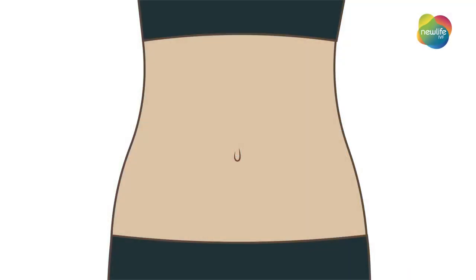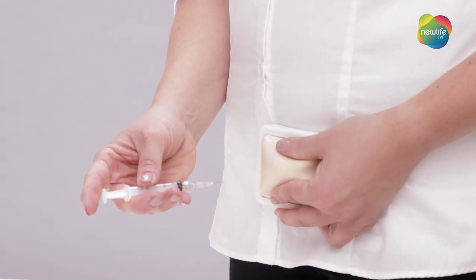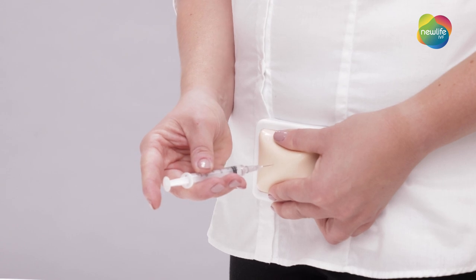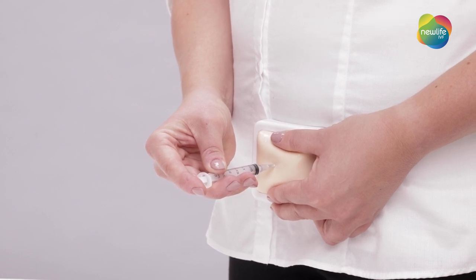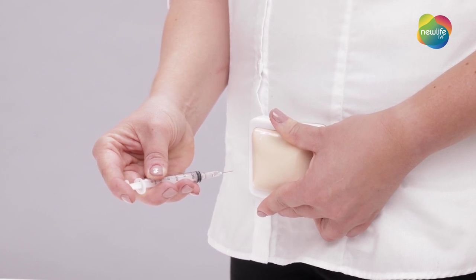This injection is to be given below the navel line, injected at least a couple of centimetres away from the navel. Make sure you rotate your injection site with each injection to avoid irritation. Now, pinch your belly using your thumb and index finger. Hold the syringe at a 90 degree angle and insert the needle into your skin. Push the end of the syringe until the dose has been delivered. Release your pinch and remove the needle from your skin. You've now finished injecting your Levaris.